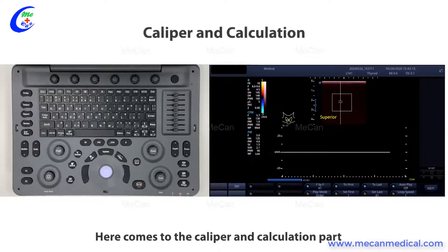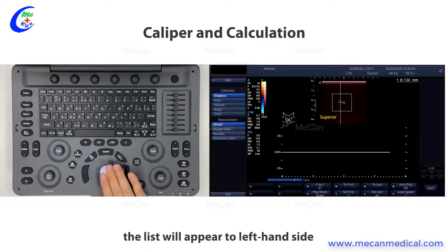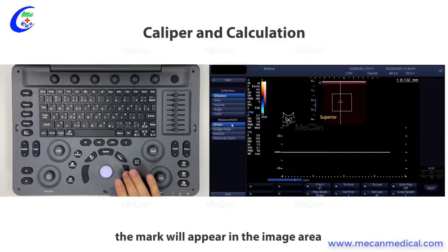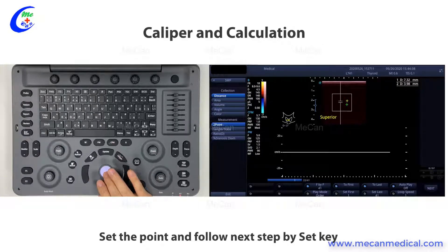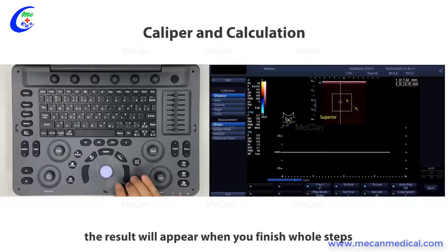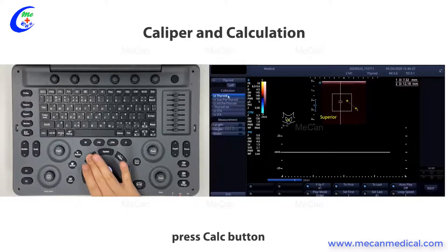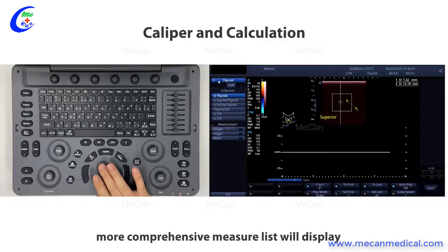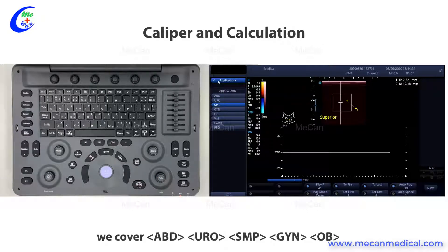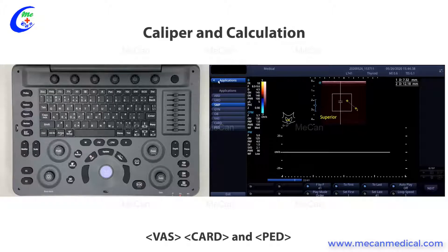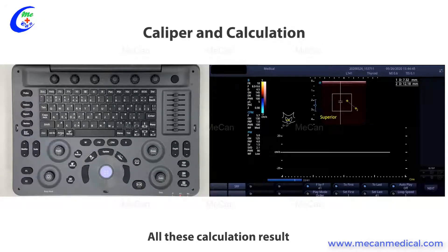Here is the caliper and calculation section. If you choose caliper to do basic measurements, the list will appear on the left-hand side. Click the measure you need, and the marker will appear in the image area. Set the point and follow each next step by pressing SET. The result will appear when you finish the whole step. For further measurement, press the calculation button — a more comprehensive measure list will display. You can choose different applications including abdominal, urology, small part, gynecology, obstetric, vascular, cardiac, and pediatric for different professional examinations. All calculation results will go to the report automatically when you finish.